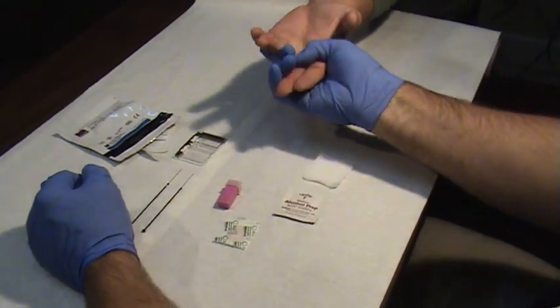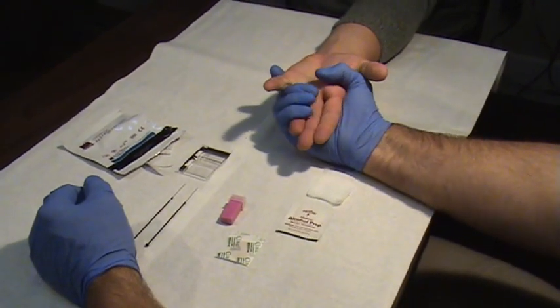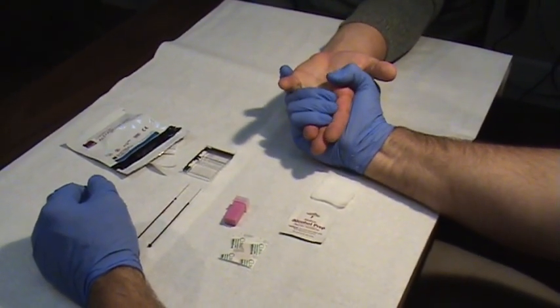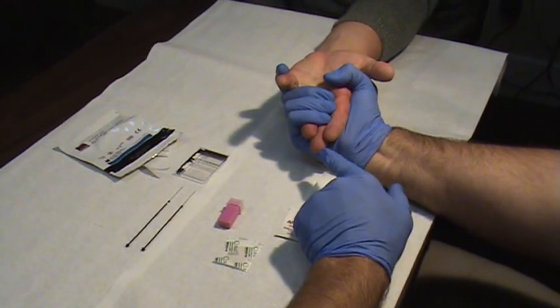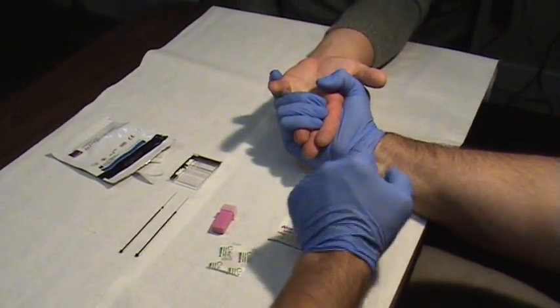When looking at your patient's fingers, you want to check all 3. Some people have colder hands than others. I squeeze all 3 of them. I'm looking for the one that discolors the most, the fastest. And so I have a choice between this finger and this finger.